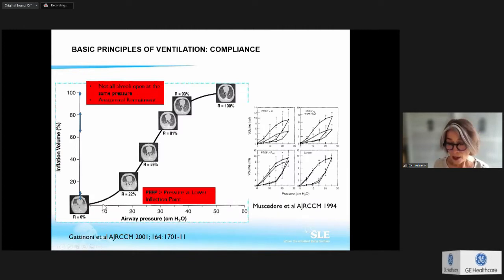And we really see it when we do, for example, lung recruitment. When we do some lung recruitment, what do we do? We go up on the pressure. And when we go up on the pressure, we might manage to open up some alveoli. So when we look at the compliance, here you see at the beginning, you have a lot of lung collapse. So when I increase my pressure by 5 millibar here, you see the tidal volume is quite moderate. When I go up on the pressure, I have maybe managed to open up some alveoli. I have less lung collapse. You can see that the collapse is decreasing.